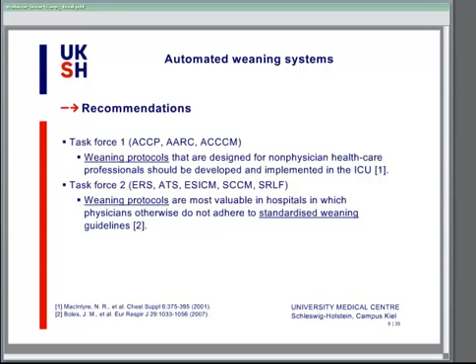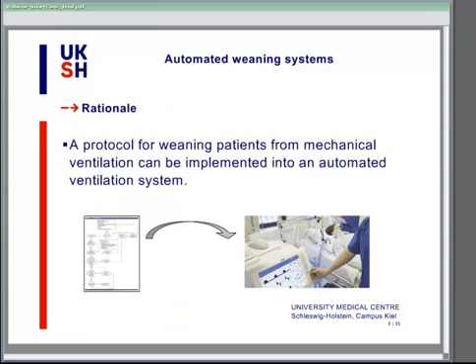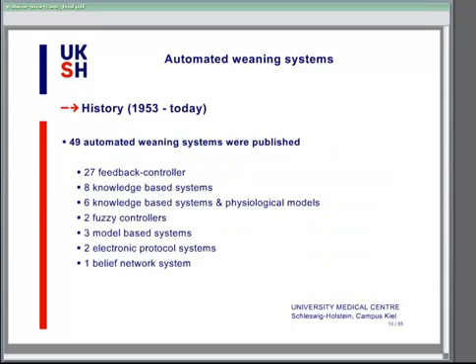to automatize such a protocol. And this is the rationale of my webinar today. So a protocol for weaning patients from mechanical ventilation can be implemented into an automated ventilation system. So when we have this idea, we have to look a little bit into the details of automated weaning systems.